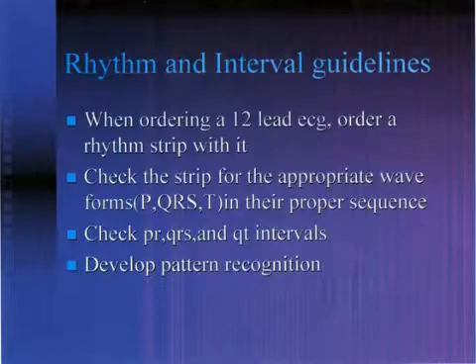Yes, rhythm is more of an interpretive process. It's not simply adding wave amplitudes together or calculating a rate. Rhythm interpretation can involve studying a strip and trying to reason through what is happening with the various waveforms. It's a fun and challenging aspect of the ECG, and with a few basic principles as outlined on the slide, even the most challenging rhythm can be broken down.